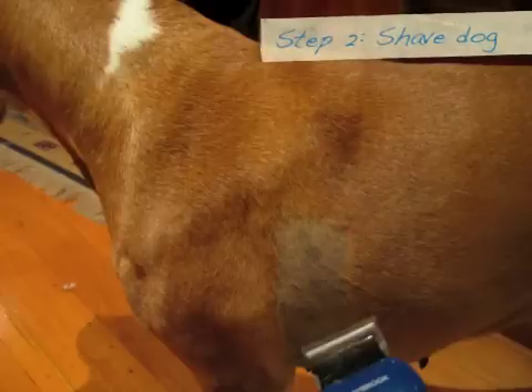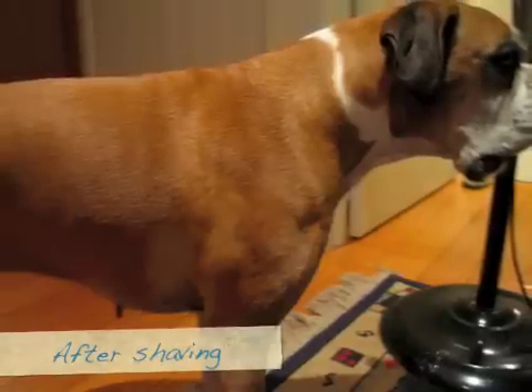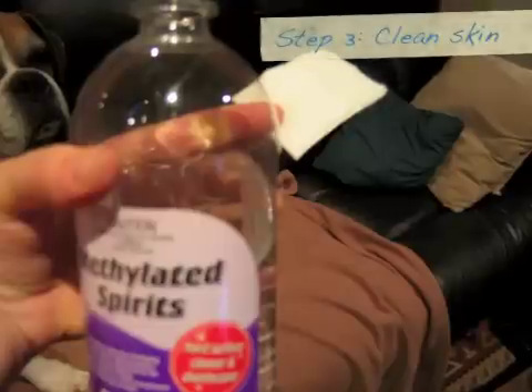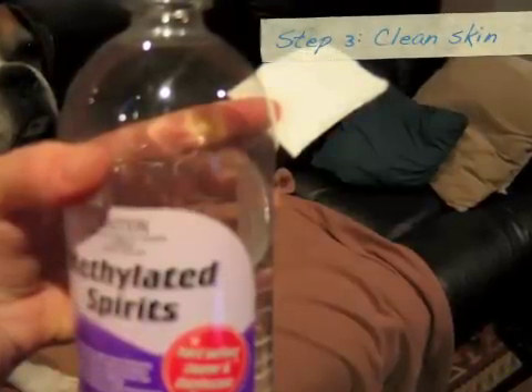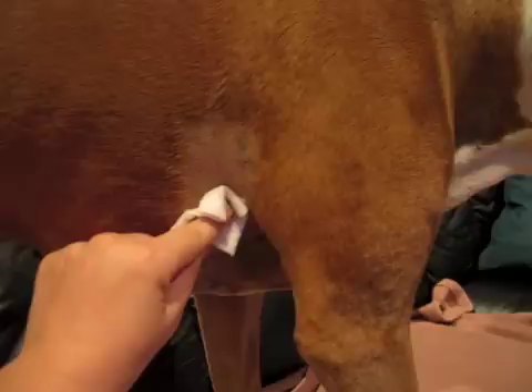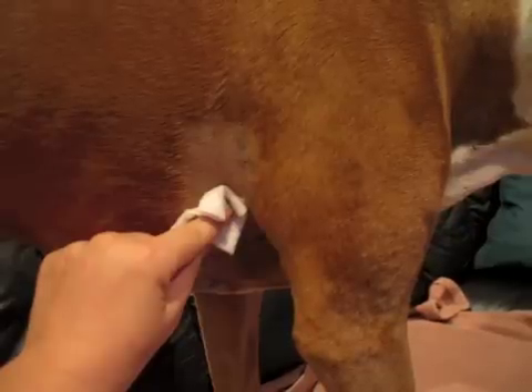Make sure the dog is shaved if you're going to go with the shaving option — just strips to make room for the electrodes. Make sure they're in good contact with the skin. You need to make sure that the skin is really clean and that means getting rid of the natural oils from the dog's skin. I use methylated spirits in a cotton pad and it seems to lift off any grease from the skin quite well.